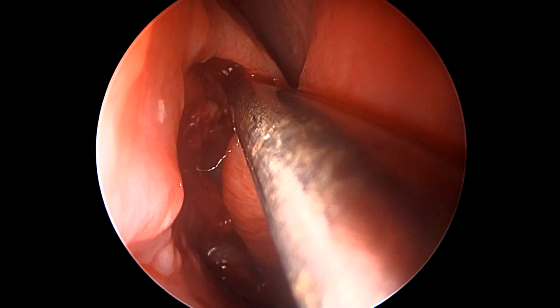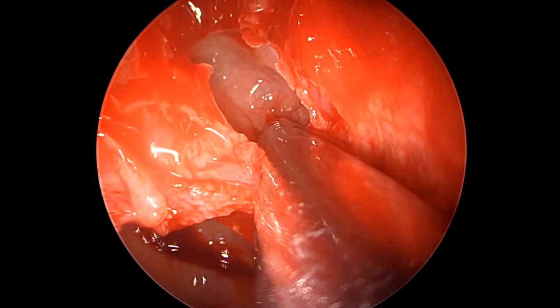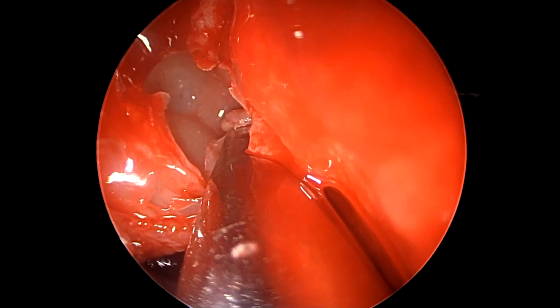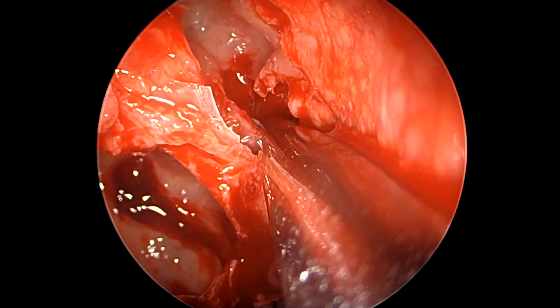As we are seeing, we are right now using a navigator probe to see where we are with regards to the frontal sinus. So here we use our microdebrider blade, matching the location of the transitional antrostomy ridge medially and inferiorly. We take our microdebrider blade to go through and penetrate the basal lamella to enter the posterior ethmoidal cavity.